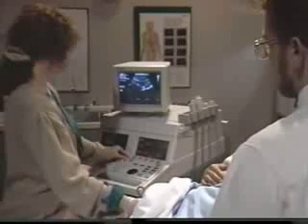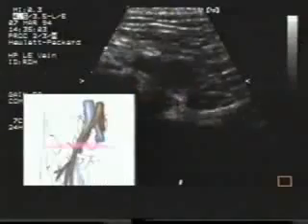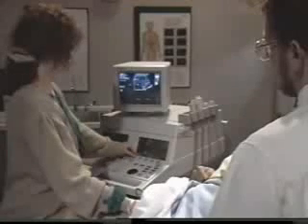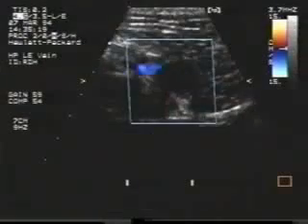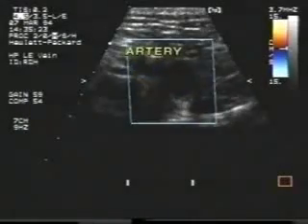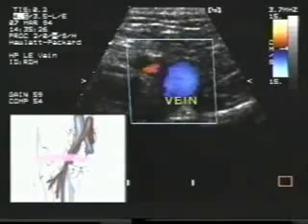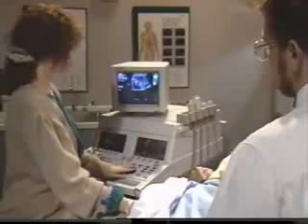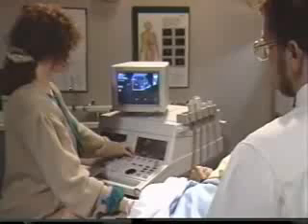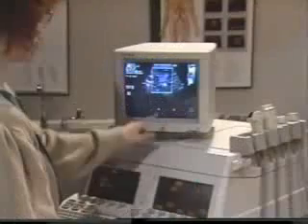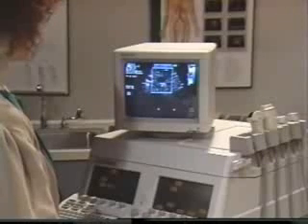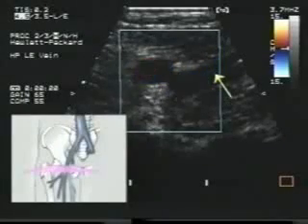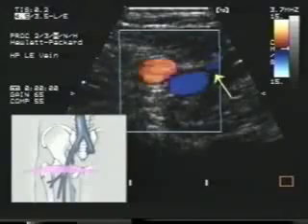Start with the iliac vessels and move down to survey the anatomy. As you survey the vessels in cross-section, use color flow and spectral Doppler to help identify which is the artery and which is the vein. The artery has a pulsatile flow, and the vein has a phasic or respiratory flow pattern. After locating the external and internal iliacs, follow the external iliac down the thigh across the inguinal canal where it becomes the common femoral. At the saphenofemoral junction where the greater saphenous branches medially, always confirm that the saphenous vein is patent. If you have any doubts about patency, follow the saphenous further down the leg.